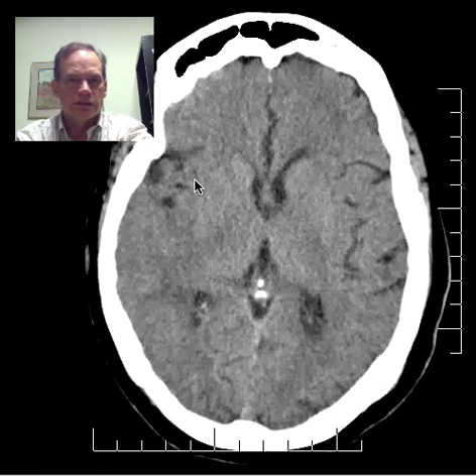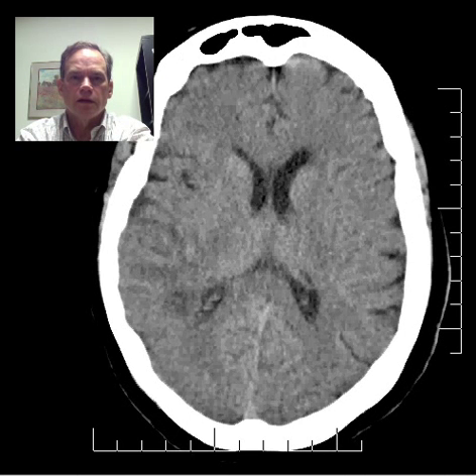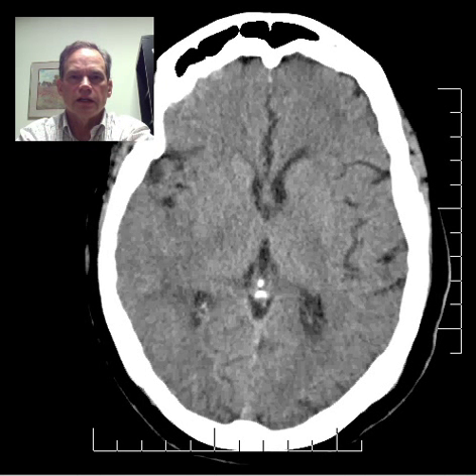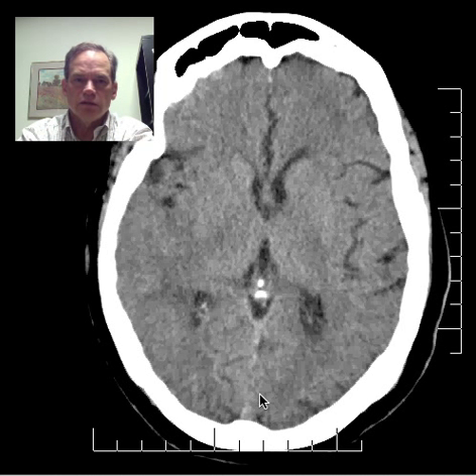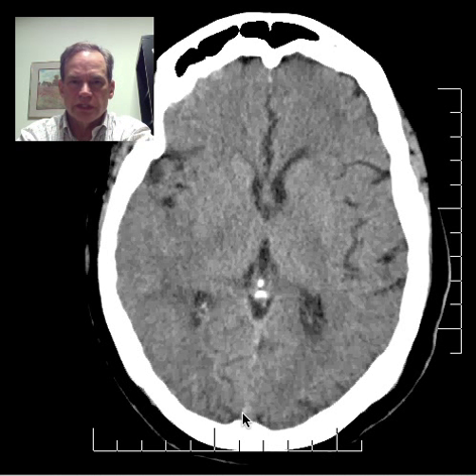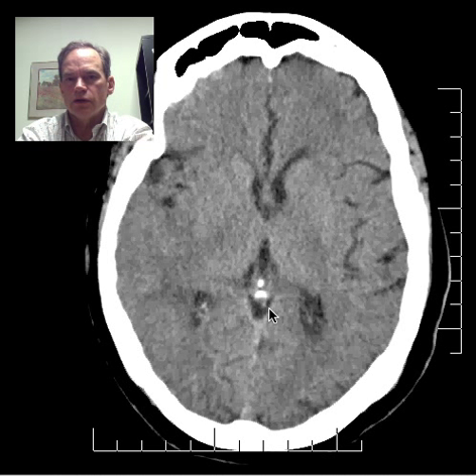Here we have the pineal gland, which is partially calcified — often the case. This little space here is the tentorial incisura.